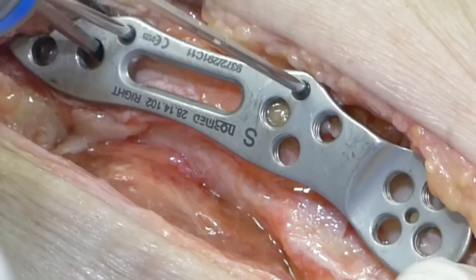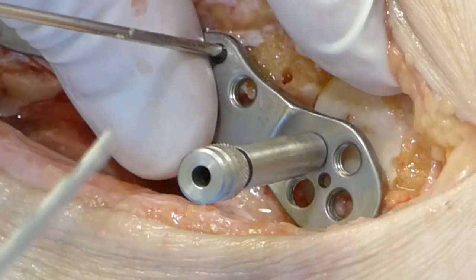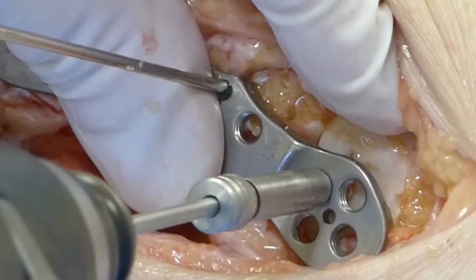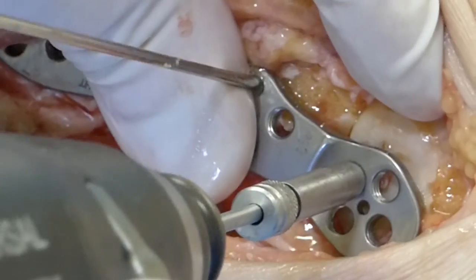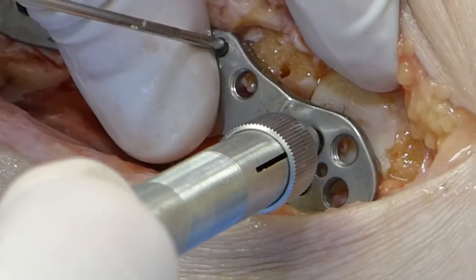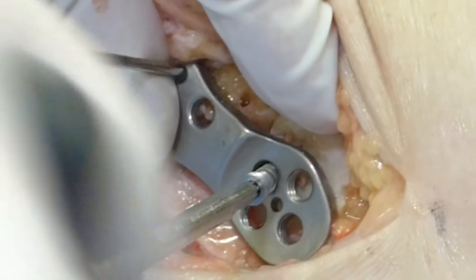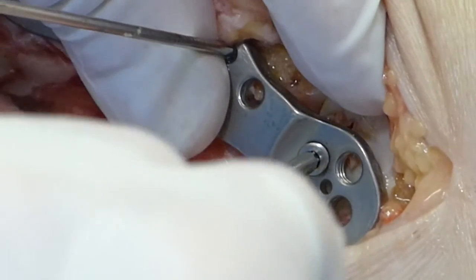The plate can then be temporarily secured to the ankle using K wires. Using drill sleeves marked with black strips, the sleeves are locked into the talar component first. Using the black drill, preparations are made to place the screws into the talus. Owing to the non-anatomic nature of the plate, the first screw may not snugly engage and lock into the plate, especially if there is some residual movement in the plate after temporary fixation.